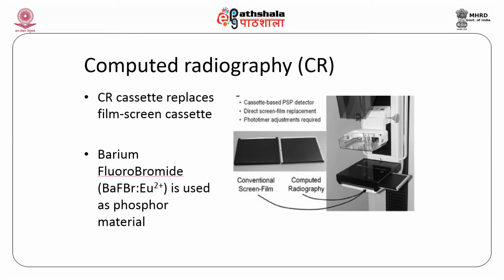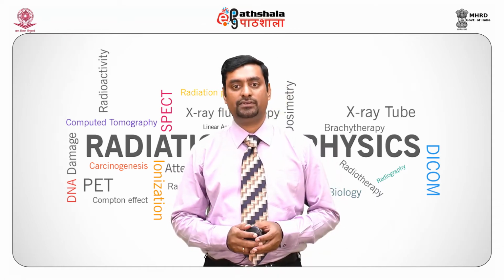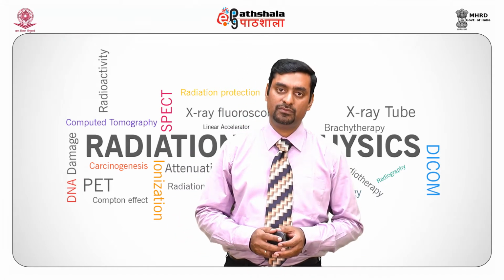Let's look into a computed radiography system. Computed radiography uses a CR cassette, which can replace the film screen cassette. It can also be used as a retrofit. In existing mammography systems which were using a film screen combination, we can use the same cassettes from CR in the slot provided for the film screen mammography system. In a CR system, barium fluorobromide doped with europium 2+ is used as a phosphor material. The cassette based PSP detector directly replaces a screen film receptor.